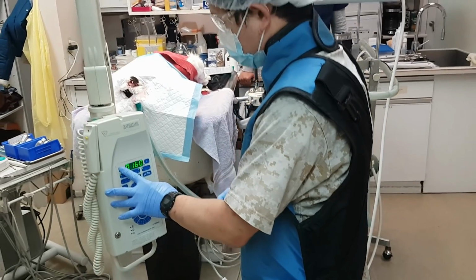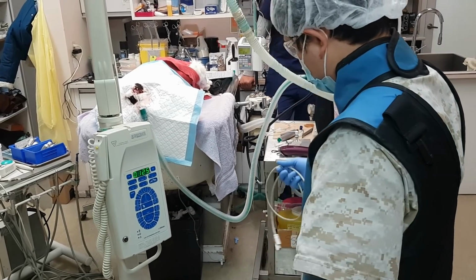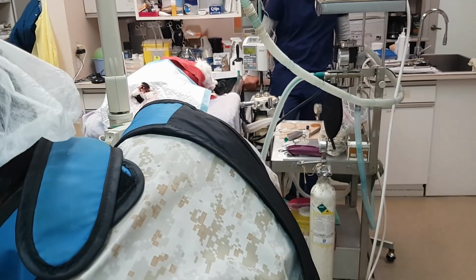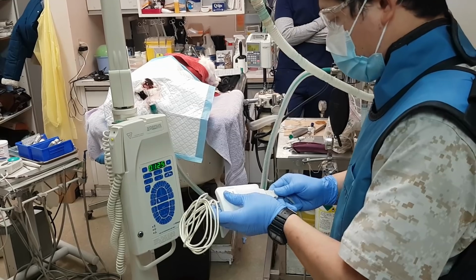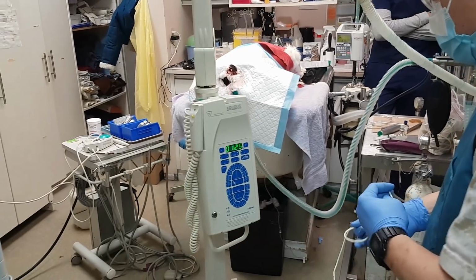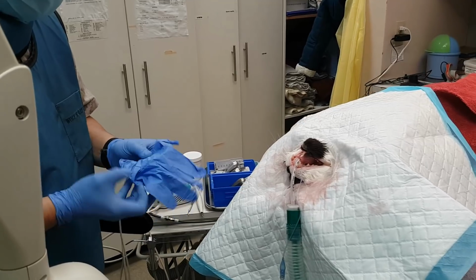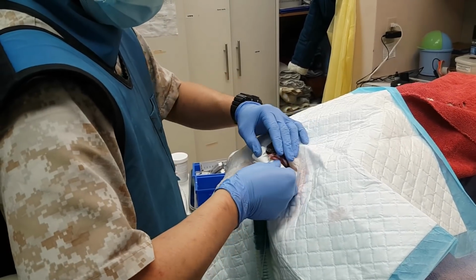Typically, a dental cleaning like this takes about 30 to 45 minutes. You see Mr. NJ setting up a dental x-ray machine, and we're about to take some radiographs of Lancelot's teeth. They've been scaled, they've been polished. Mr. NJ has assessed the teeth, and now we can do some x-rays. And then the doctor, who happens to be me on this day, is going to review the radiographs and probe the teeth and make some decisions about whether any of those teeth need to be removed.